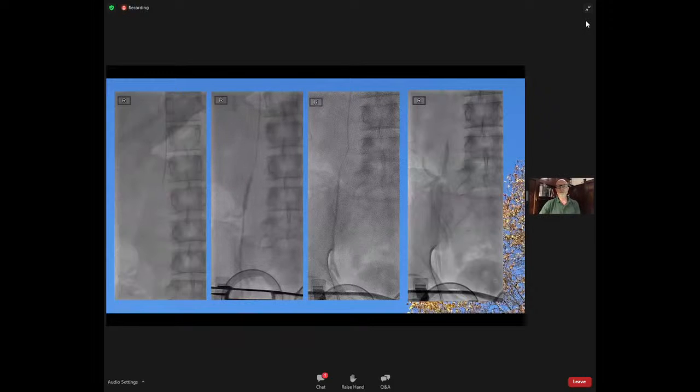You can see the femstop at the lower part there, and then laying out that sodium tetradecyl sulfate with the femstop in position, with a nice column of sodium tetradecyl sulfate seen on the right image, and nicely filling the vein. You can see at the end it's quite a big vein, and that's probably the size of the vein during the normal working day, or during the normal day being upright.